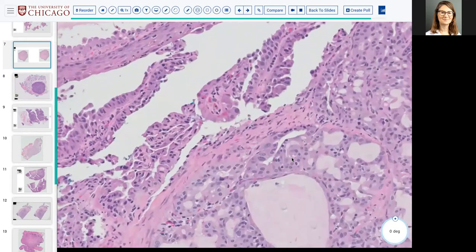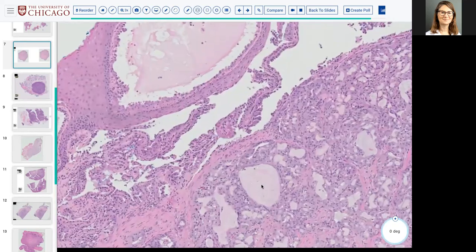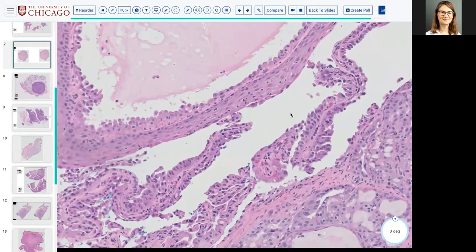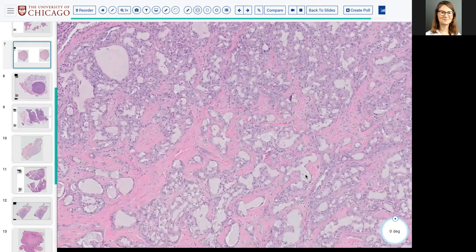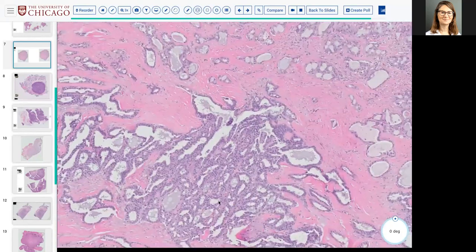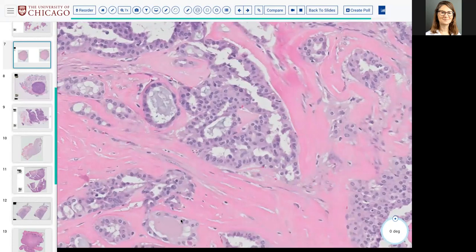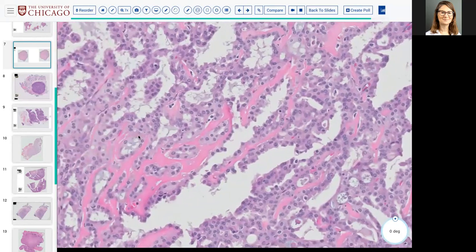That would be the one thing I would say about invasion. Two, intraluminal secretion in the center here with this hobnail growth pattern. One point to make is, when we speak of secretion and mucin, something that's being produced by the cells, we want to make the distinction between true intracellular or intracytoplasmic mucin, foamy vacuoles, or intraluminal secretion or intraluminal mucin. Because only the presence of intracytoplasmic mucin is going to push us more in a mucoep direction.